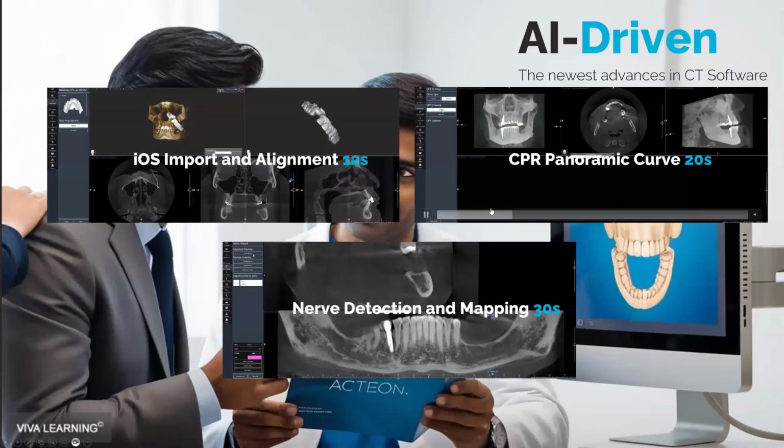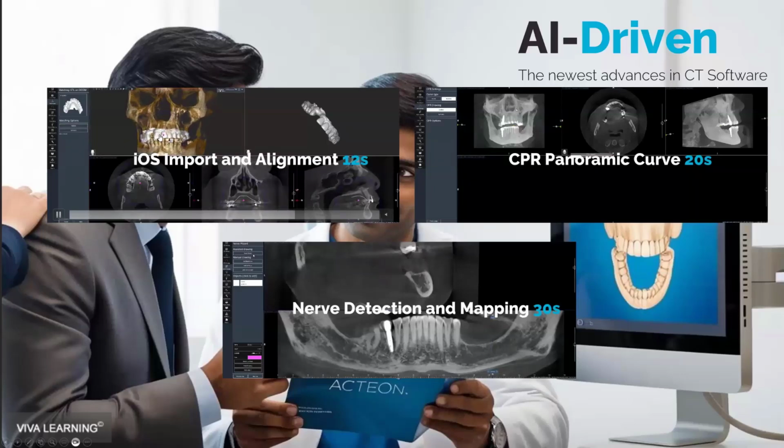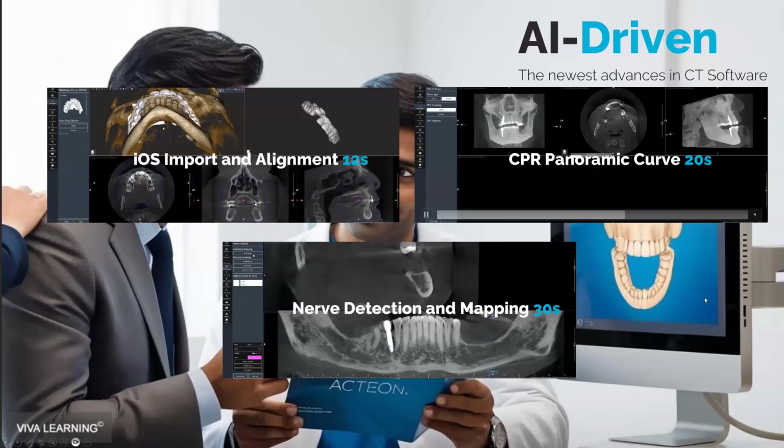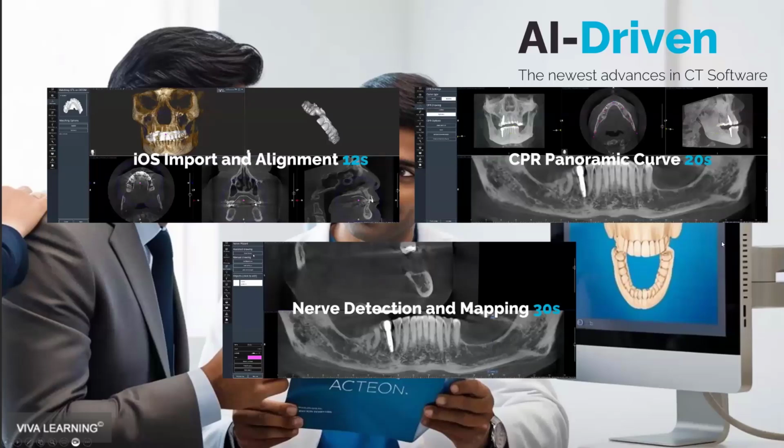So what we see here is about 12 seconds to automatically align an intraoral scanner, so you no longer have to pick the points. It does a really nice job doing that. About 20 seconds for it to automatically do your panoramic curve, so that's for maxilla and mandible. We'll talk about that curve and what the ideal curve is. And then a little bit longer, about 30 seconds, for it to find the nerves for you.